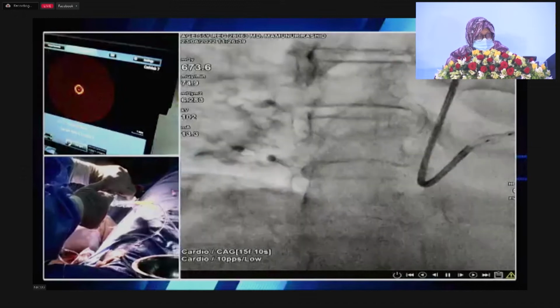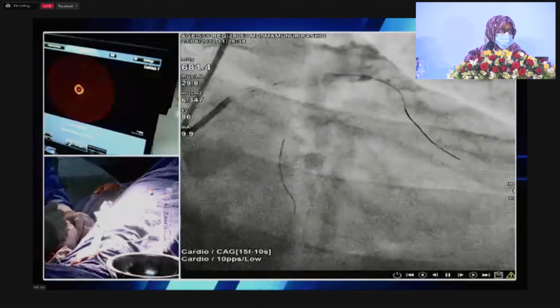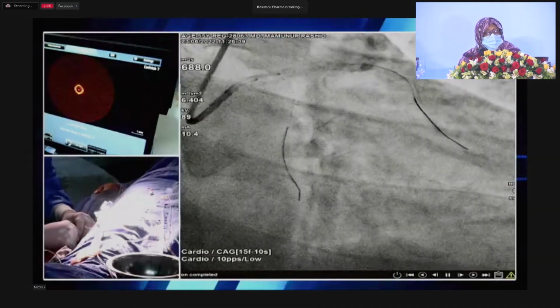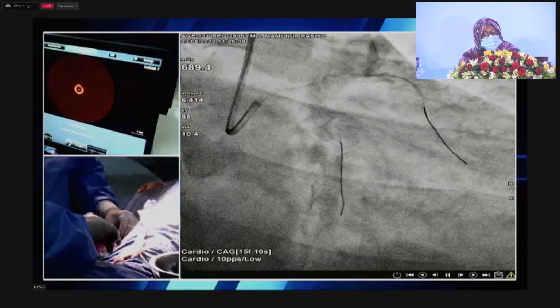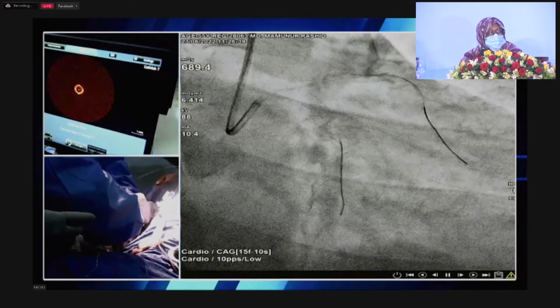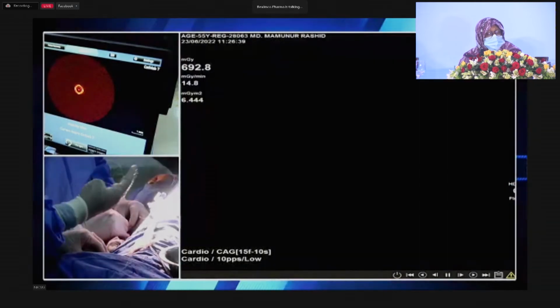A couple of things we have to remember is that when you are using a long stent, you have to give the metal time. I'm sure Dr. Gambhir has experienced that with long stents, you don't have to do it in one go of 1 minute or 50 seconds or 40 seconds. Mainly when you're dealing with main stem, you can divide it. First 15 or 20 seconds, give a break, and then do it again. You must give the metal time. In the days when we used long stents without IVUS, we saw later on that some part of the stent doesn't expand properly. So you have to give the metal enough time to expand. When dealing with main stem like this, you can always divide the time, but your job will be done. I think that is the better strategy to follow.